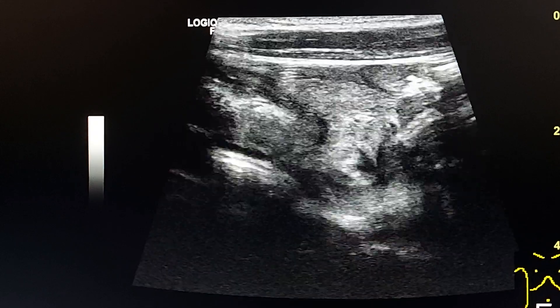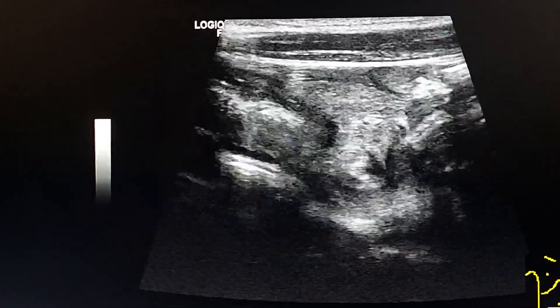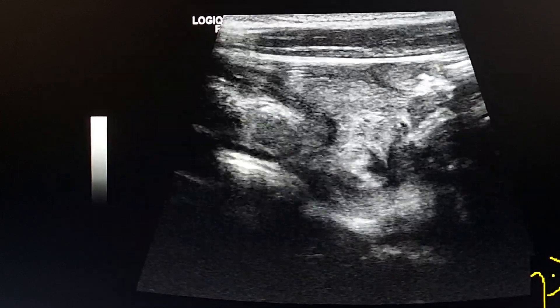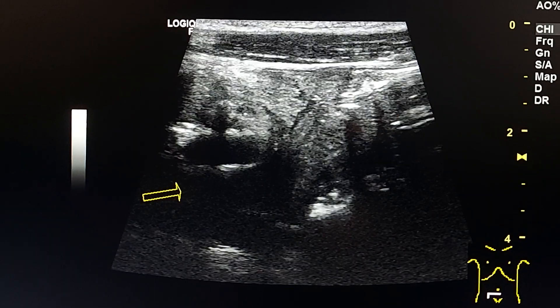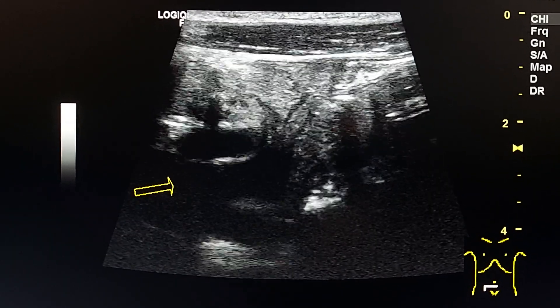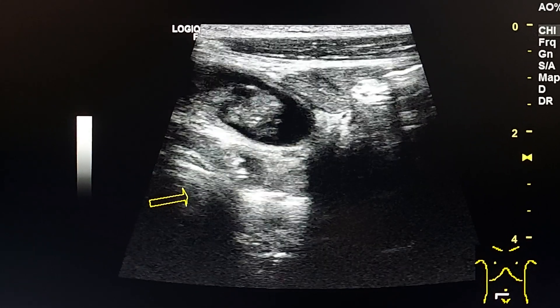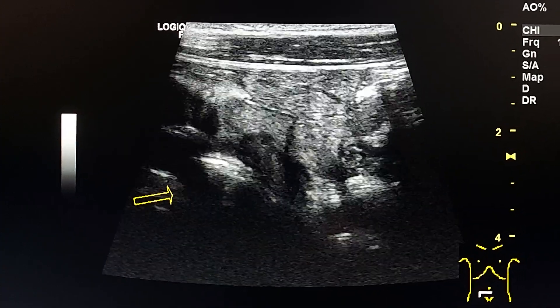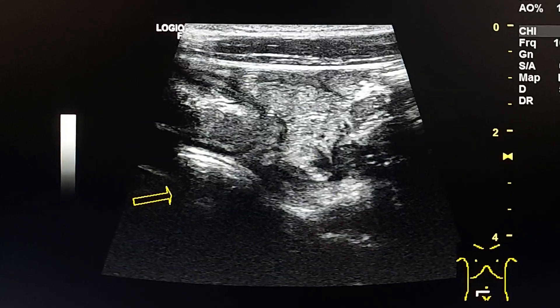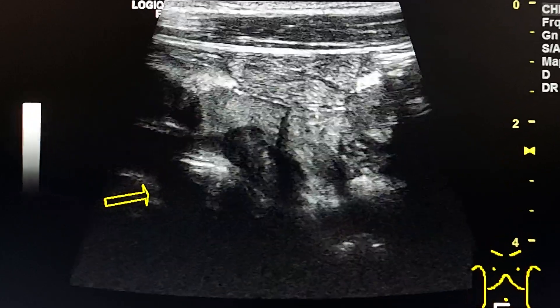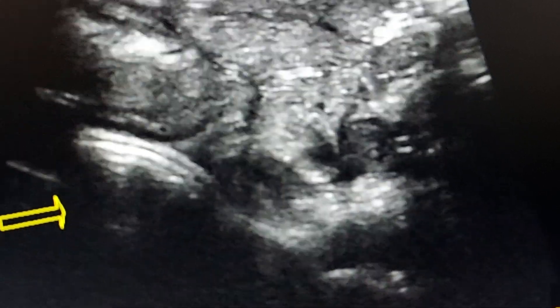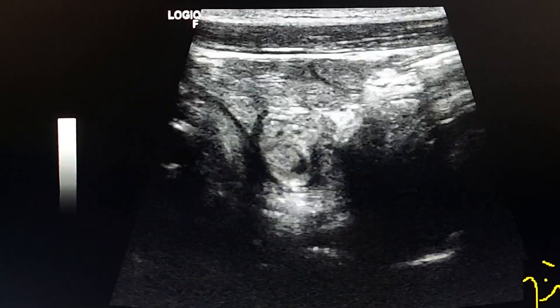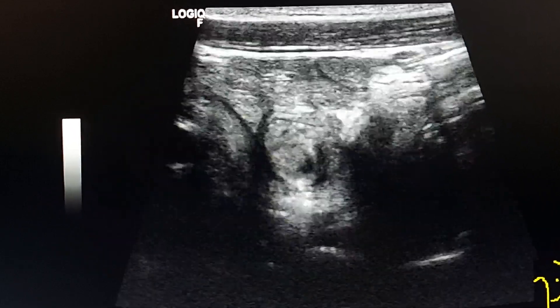Here we see a long axis view of the right iliac vessels. Next to them is the diverticulum and the whirlpool sign. We see the whirlpool sign here in this view more clearly.